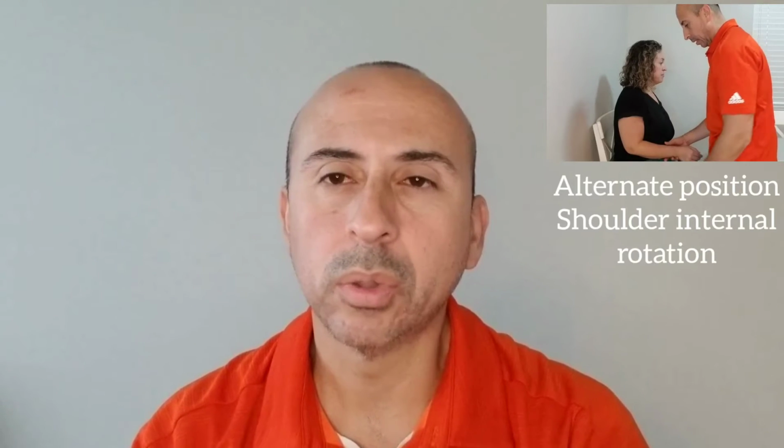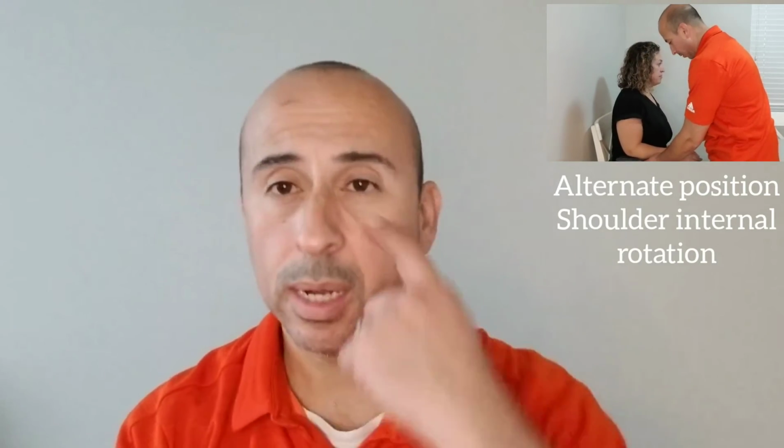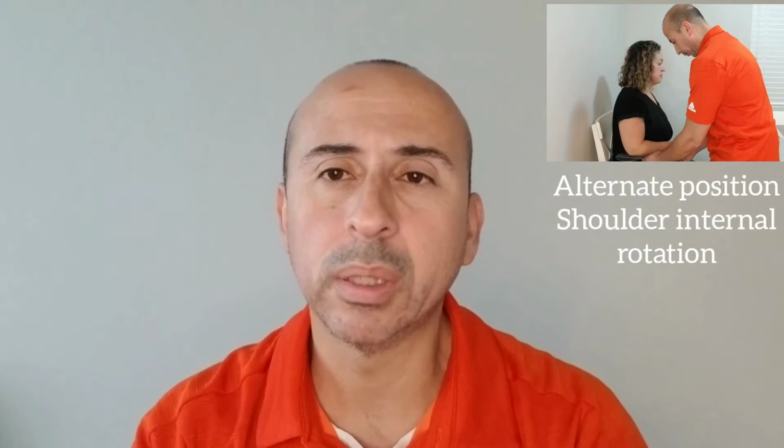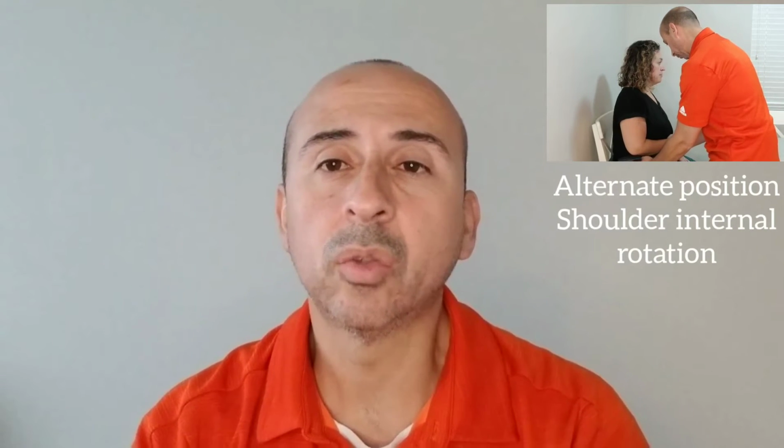One important thing to consider too is obviously the client's ability to move the joint. Most of the time, similar to manual muscle testing, I always try and have the resident or the client move their arms so I can eyeball and see where they're probably going to be at. It also gives me an idea if there's things going on.